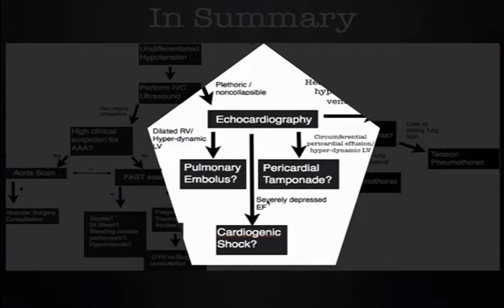You need to go ahead and get inotropes on board, as well as your fluid resuscitation and vasopressors. If there's a circumferential pericardial effusion with a hyperdynamic LV, in addition to a plethoric non-collapsible IVC, then you assume pericardial tamponade. You go ahead and pull the pericardiocentesis tray to the bedside and mobilize consultation versus transport to a facility that can provide pericardiocentesis.